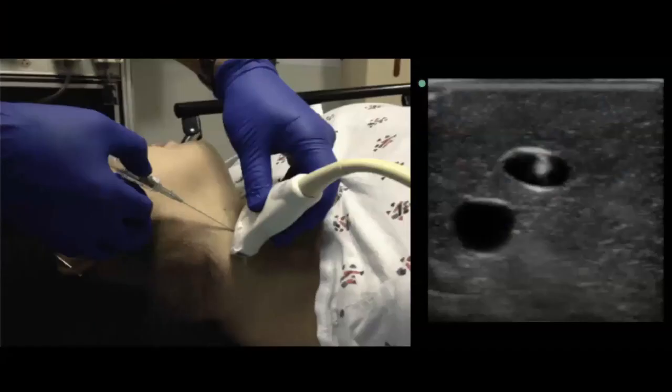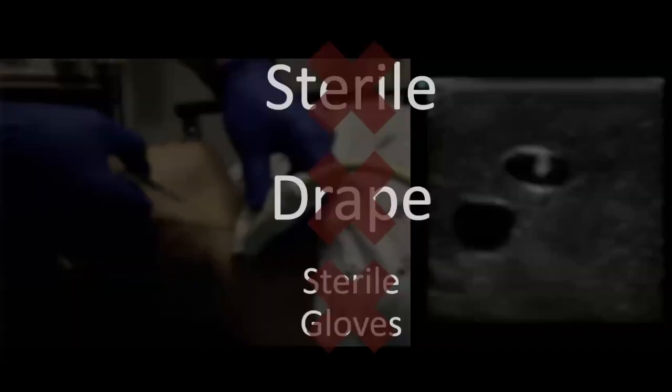And then you put the probe on with your sterile jelly, and you just go ahead and cannulate the internal jugular vein like you're doing a central line, but with a long IV catheter that you would use for any other peripheral IV. This is not a sterile procedure. You do not need to drape the patient, and you do not even need to put on sterile gloves. This has been studied. It is a really nice line to have in your back pocket if someone's super hypotensive and there's nothing peripherally, if they're in hemorrhagic shock, if you need something a little bit beefier to infuse a little bit faster, and we don't have a bunch of time to set up for a central line.